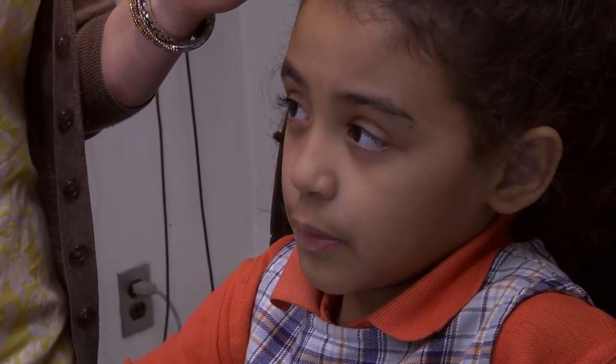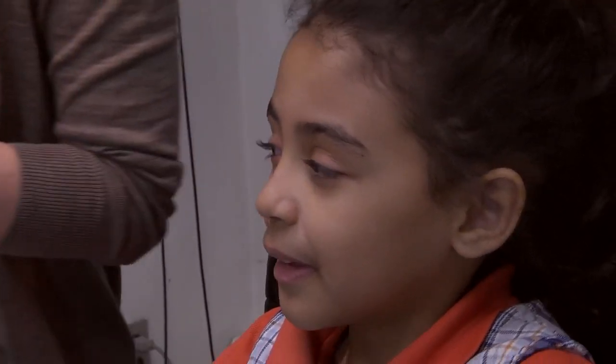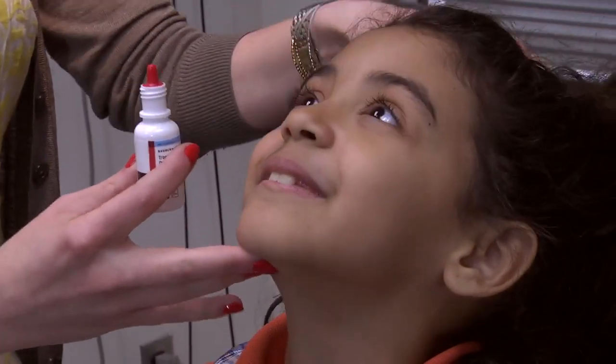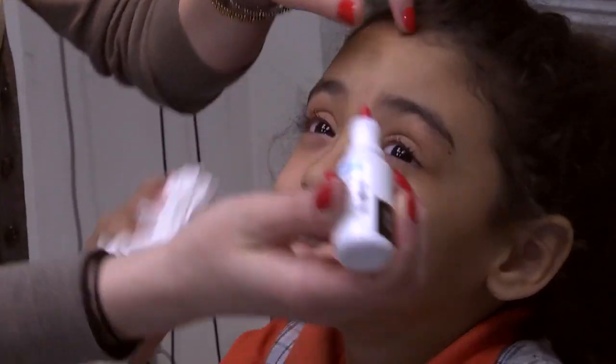This is a very important step during the eye exam. Oftentimes in children, the focusing system is very strong. So while we have a prescription before we put the drops in, sometimes the prescription can change once we have the drops in the eyes.